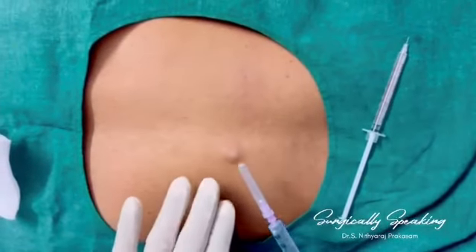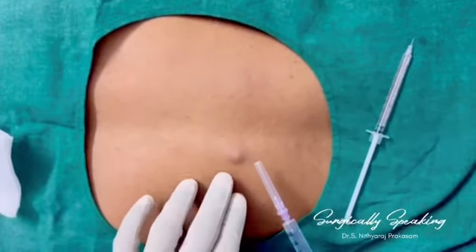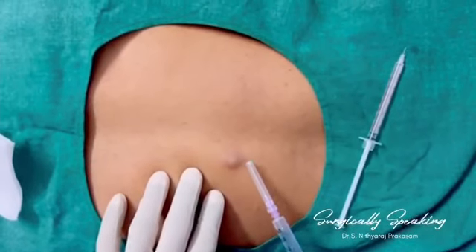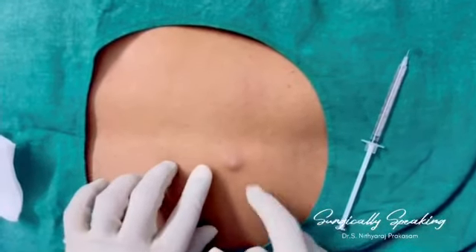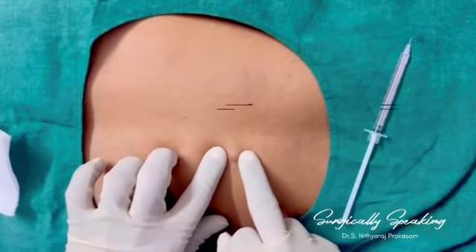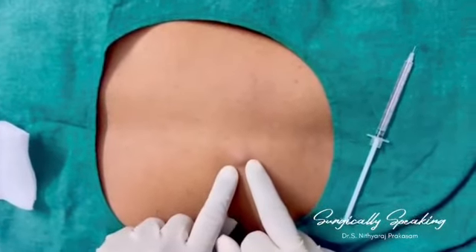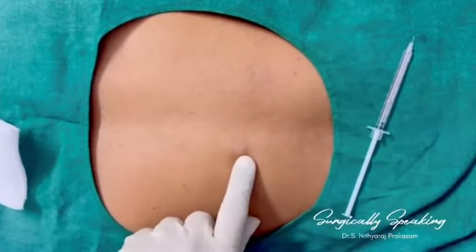This is the sebaceous cyst at the back, probably infected. I'm going to try to excise it, which will be difficult. But if it's difficult and grossly infected, then I'll have to come out after doing an incision and drainage.